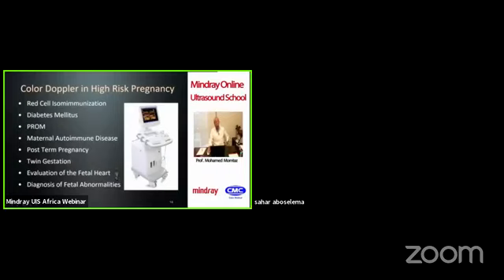Other uses of color Doppler in high-risk pregnancy will be in red cell isoimmunization, diabetes mellitus, premature rupture of membranes, maternal autoimmune disease, post-term pregnancy, twin gestation, evaluation of the fetal heart, and diagnosis of fetal anomaly, as we said.